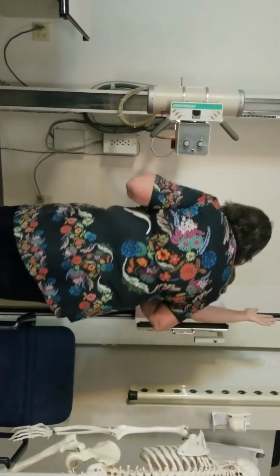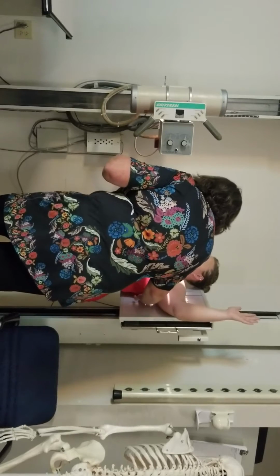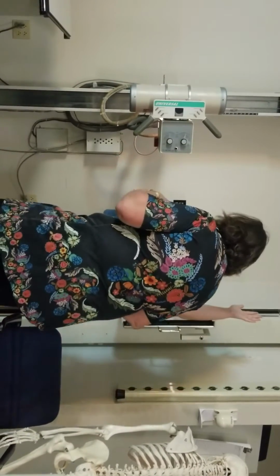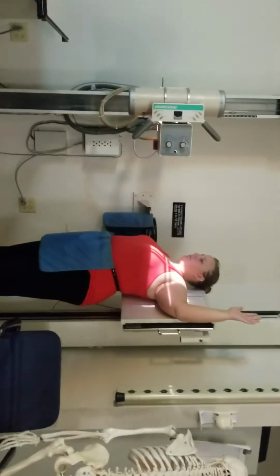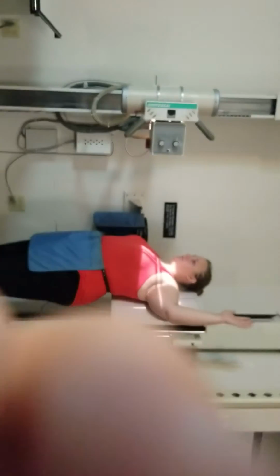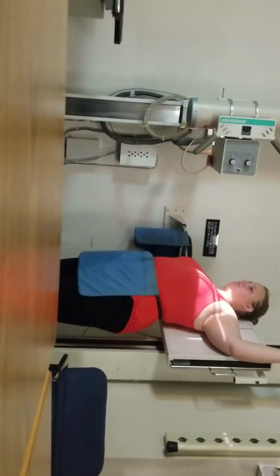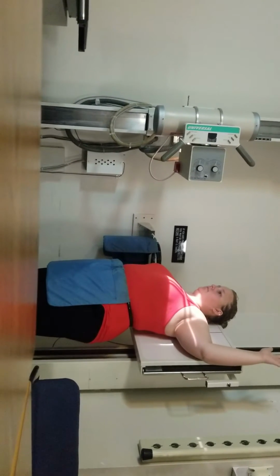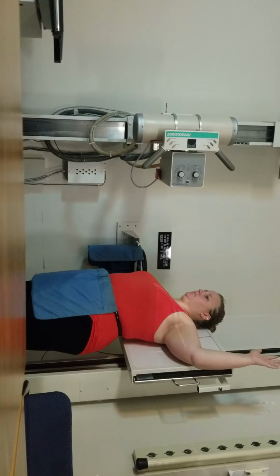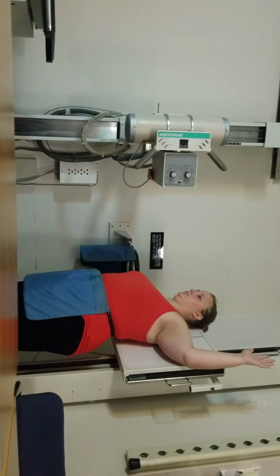All right. So I got my left marker up above her shoulder. We have a little bit of light above her shoulder. I want to make sure that the inferior angle of the scapula is on my film. Now, this is the tricky part. Now, in some of our digital rooms, we aren't able to do a breathing technique. If we could do a breathing technique in here, I would, but I can't really get a breathing technique.